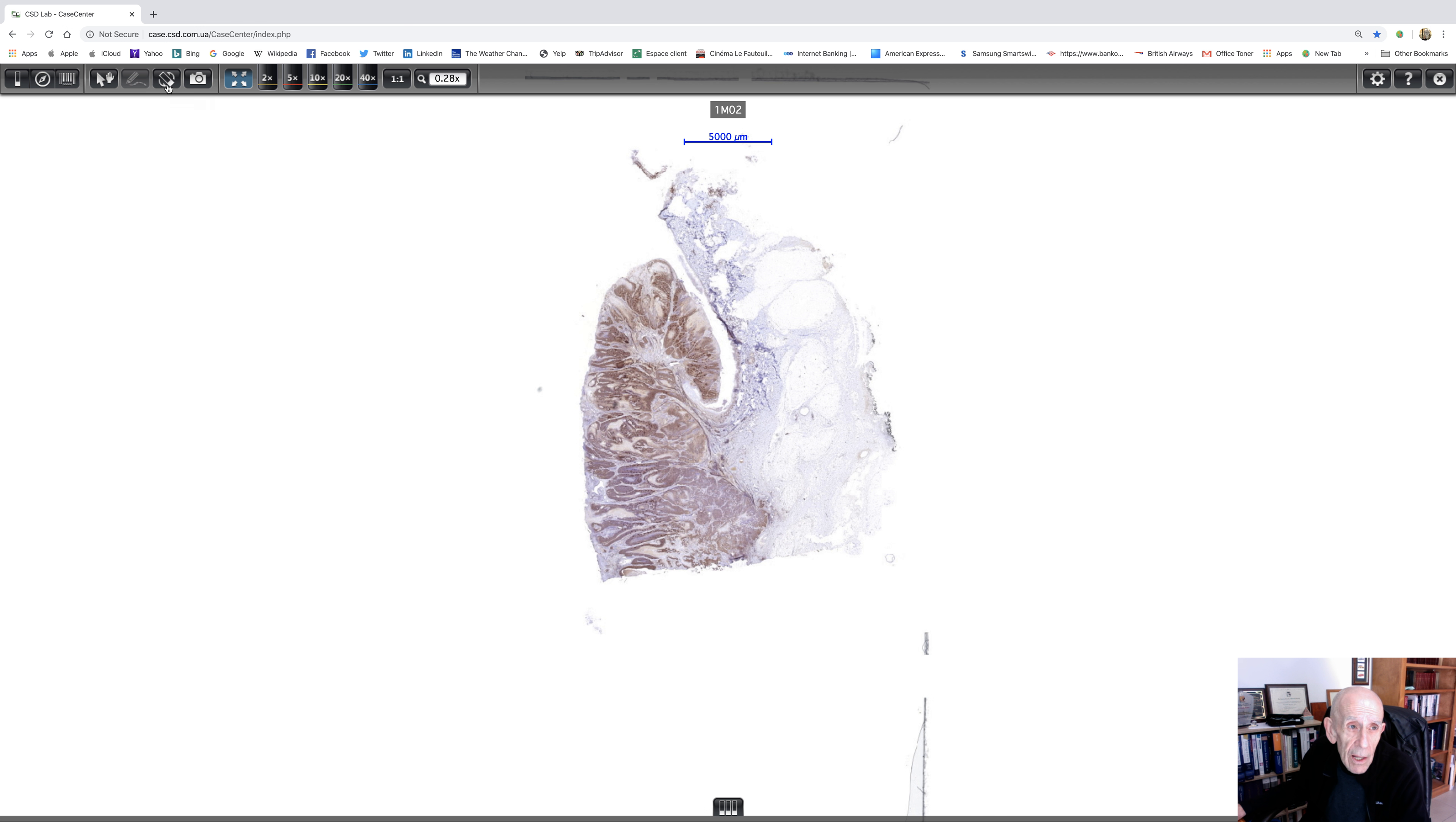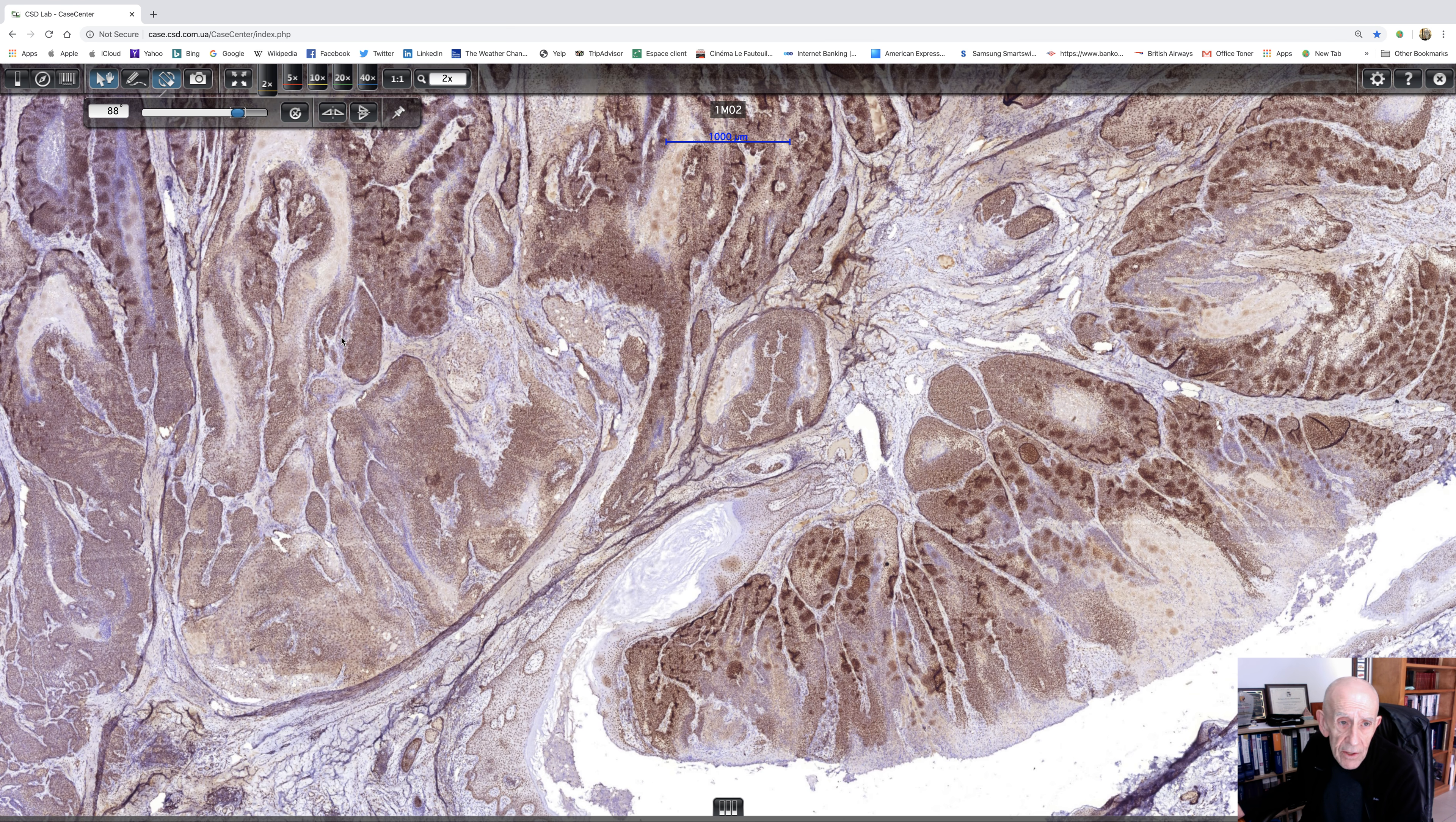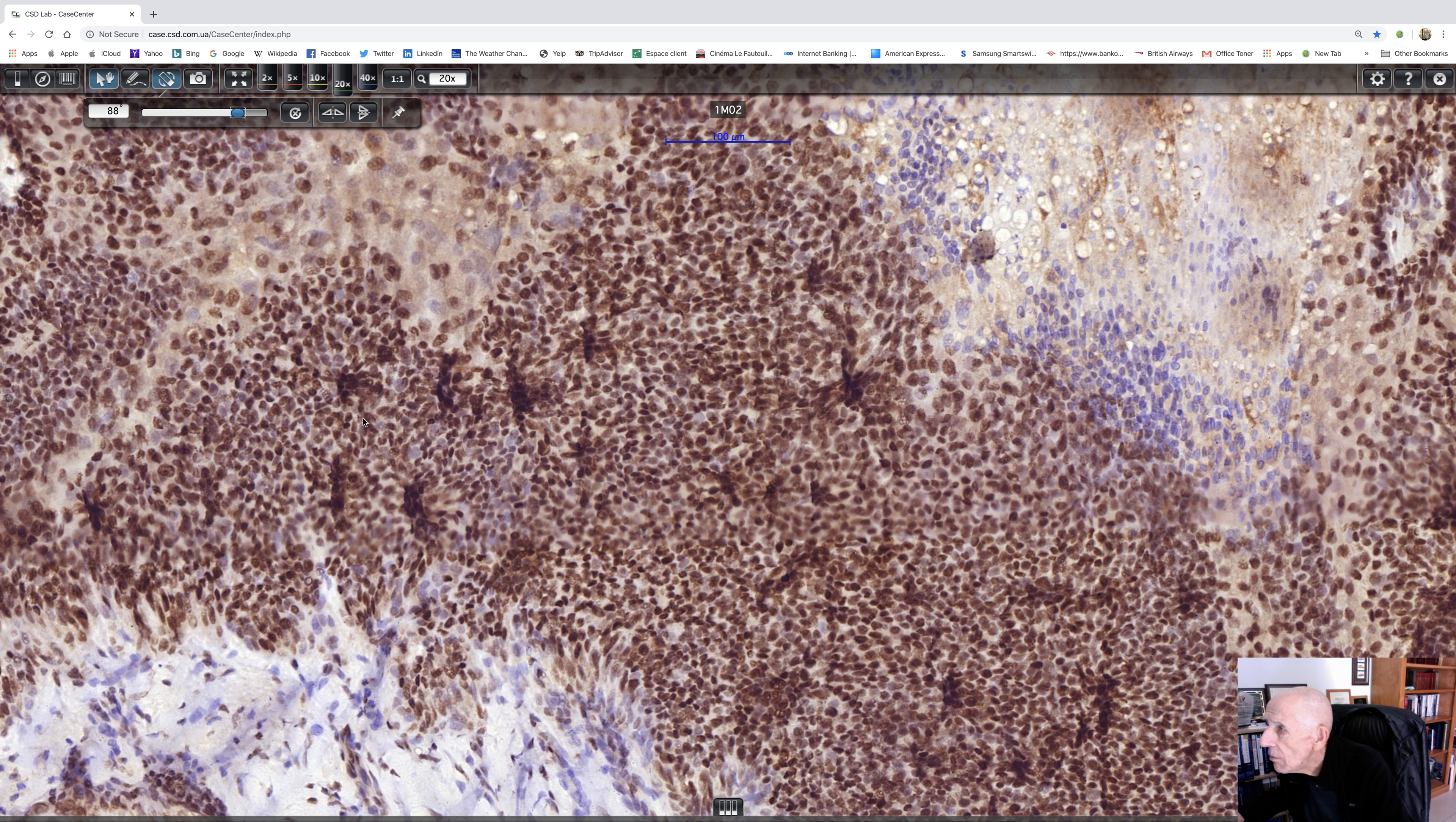Oh, isn't that lovely? Now look, this is MLH1. And I'm going to turn it round. So this is the mismatch repair gene. I'm just checking this. Yes, this is MLH1. So we'll get that in the center. And well, now the funny thing is there's a very strange artifact going on which one has to ignore these dark bits where I think the tissue is crinkled or folded. But having said that, it's pretty obvious that the nuclei are virtually all staining up. So there's no loss of MLH1.